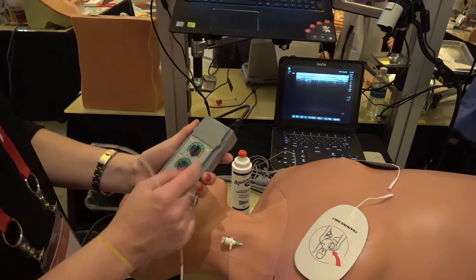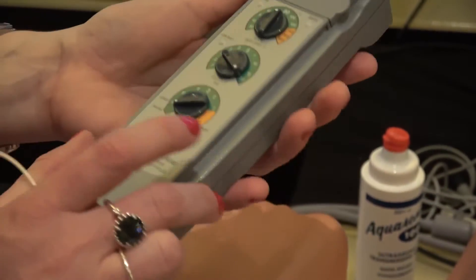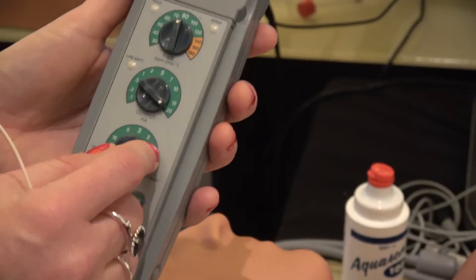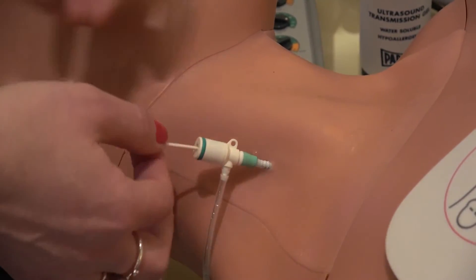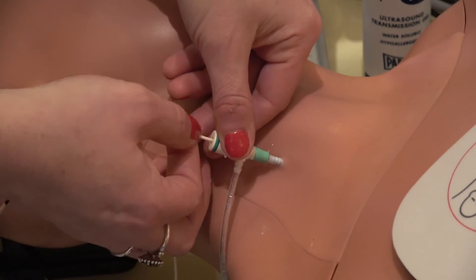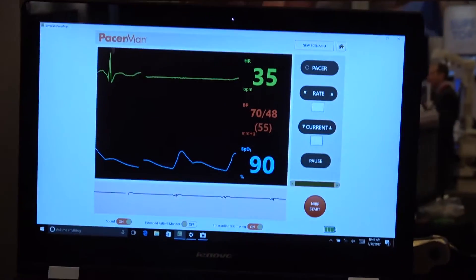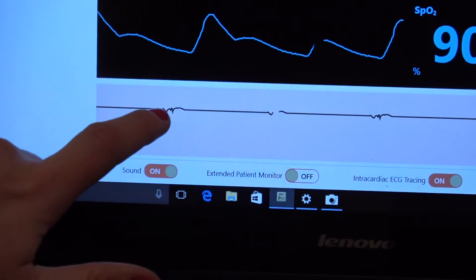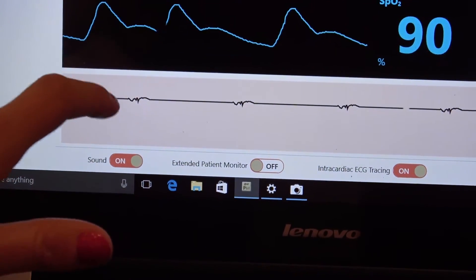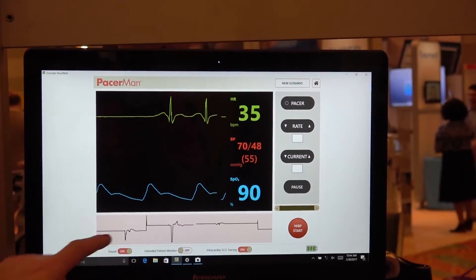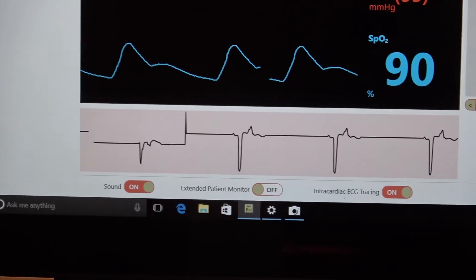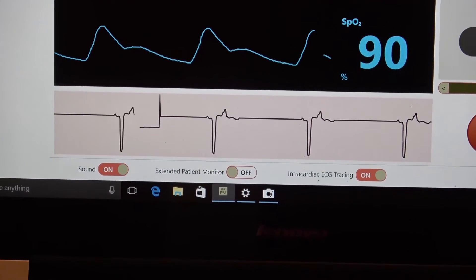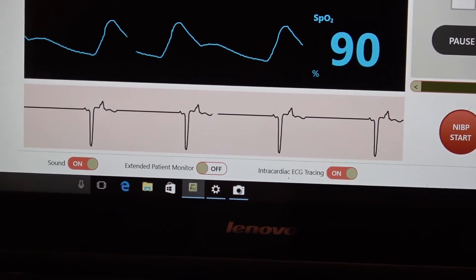I have our generator set at 80 and at our highest milliamps because we just want to get capture, and I have it on asynchronous mode. At about 15 centimeters I would inflate my balloon because we're past the cordis, and I keep moving. You'll notice on the EKG machine when we start getting in, you'll start to see this little pattern — a small QRS — telling us we're above the heart in the superior vena cava. Moving forward, the Pacerman will recognize the movement of the lead as we go from the atrium into the ventricle, and our goal is to see that current of injury pattern to confirm we're against the wall.